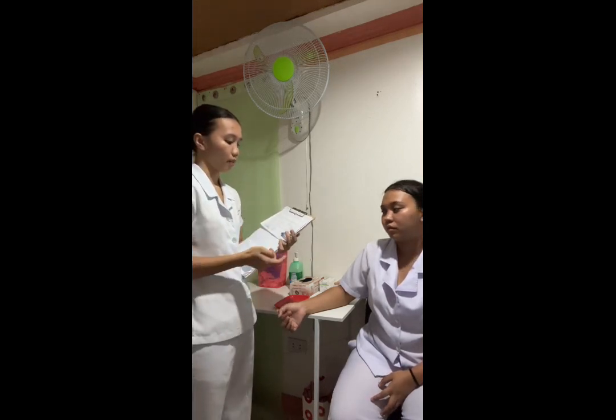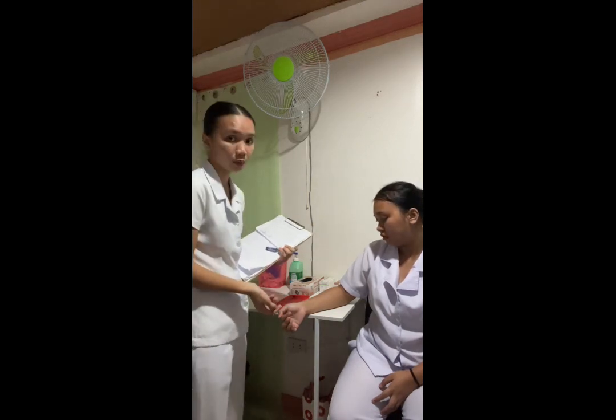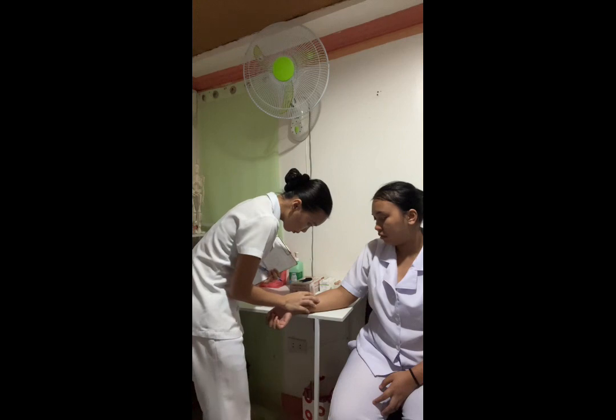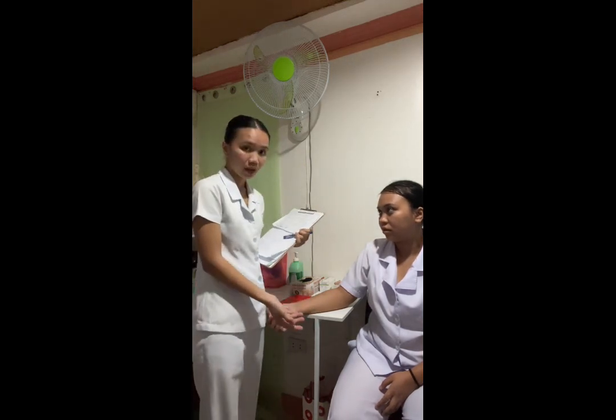So assuming that it is already 30 minutes later, I now have to evaluate the injected site, which I had already marked with a pen. So let me see it now. Okay, so since there is no redness and inflammation, the patient is negative in the penicillin allergy test.